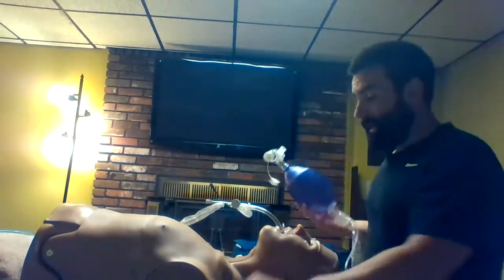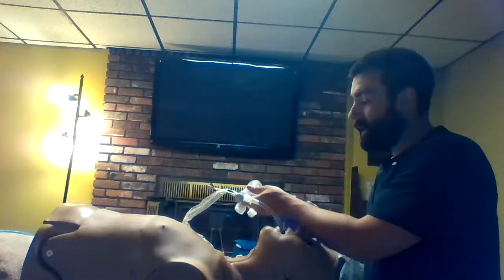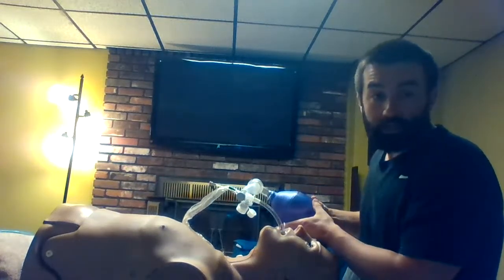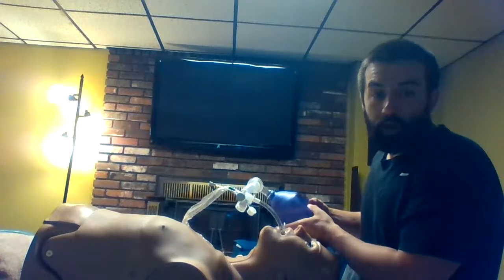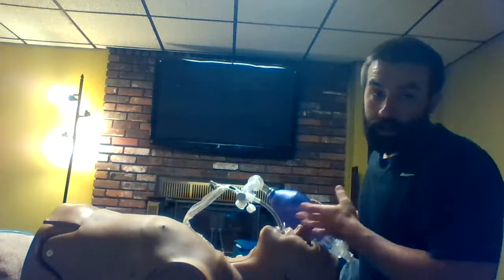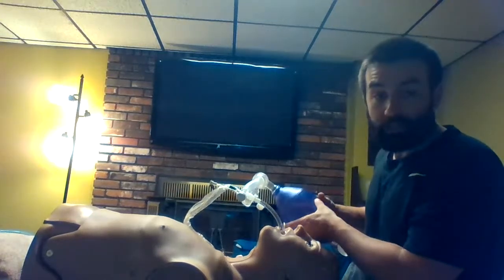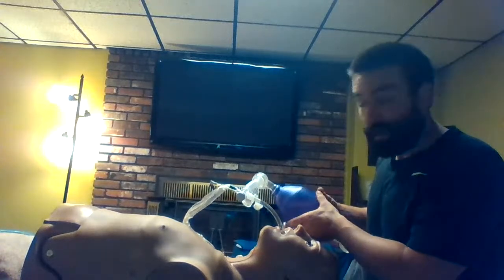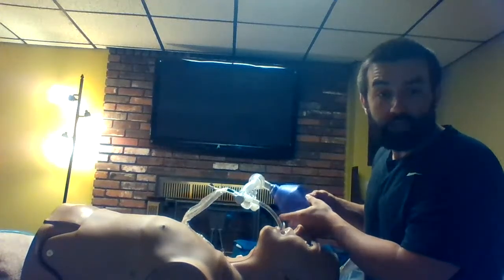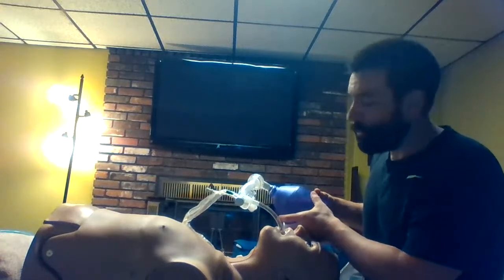So the first thing we want to do is get our airway secured a little bit better. We're going to begin by applying manual ventilation. As I'm pushing these breaths in, not only am I going to be assessing the changes in vital signs, but I'm going to be looking at my patient. If you notice here, I'm squeezing the bag. I'm not having to squeeze really hard, which tells me a lot, right? It's not like I have a mucus plug or a kinked tube or anything like that.